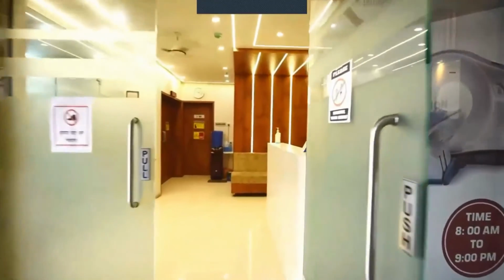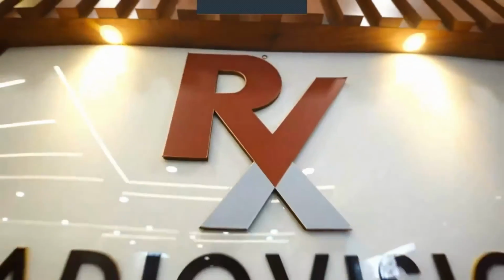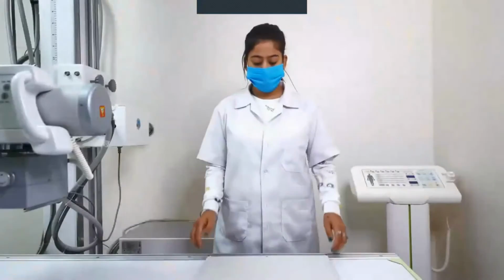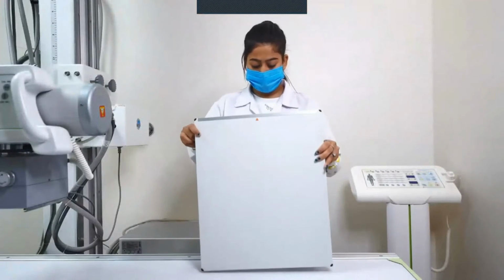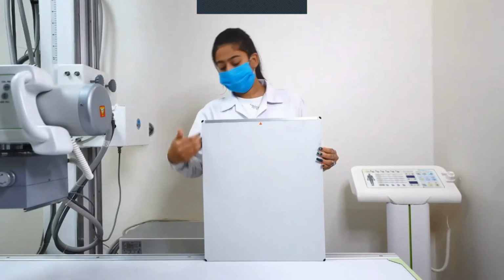So this is our diagnostic center in Pune. This is our reception where we do the registration of patients. The technician, she is showing the cassette. This cassette actually measures 17 inches by 14 inches.